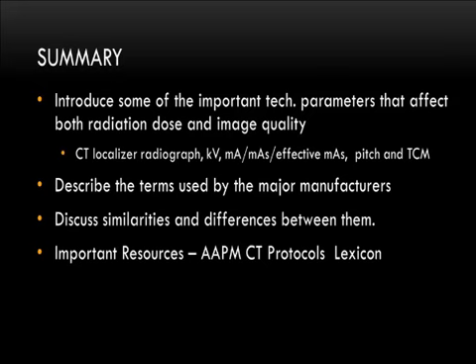But we do get some of those where we are. In fact, like I showed you, we do have patients where the quality reference mAs or the actual average mAs is lower than that. So we do get some of those smaller patients.